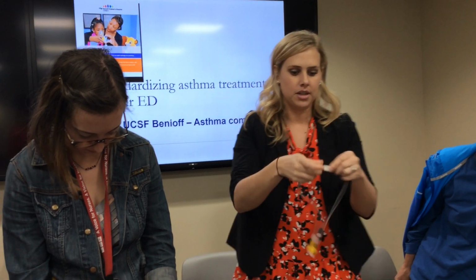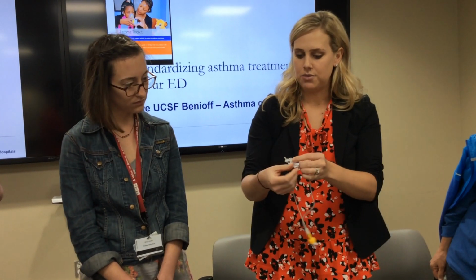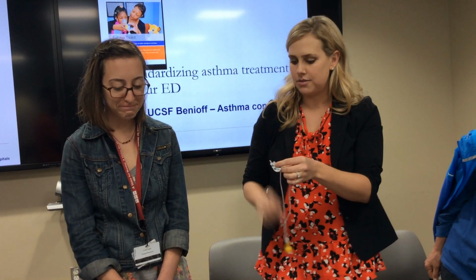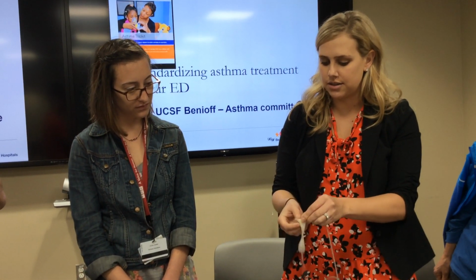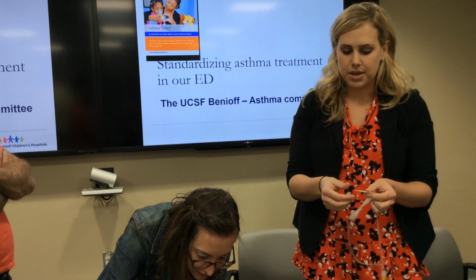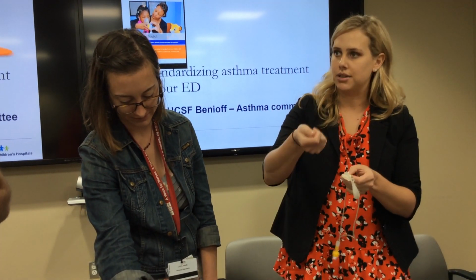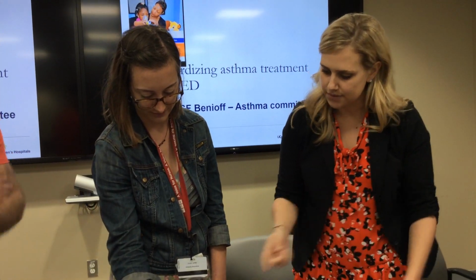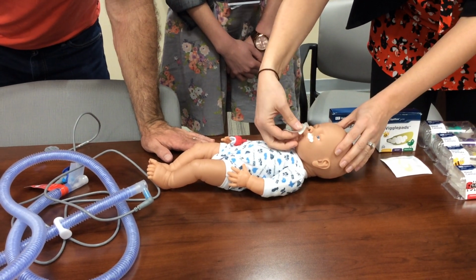As you come down to the nares, or the prongs here, they are actually independent flows, so they do not meet in the middle. If you remove one side or peel it back, the patient is still getting some kind of therapy, but you can do any kind of cleaning or suctioning you need to. What's nice with these cannulas is the little pads on them called wiggle pads. They take the place of dots or tape. It's a hydrocolloid material with a little Velcro on it. You can peel it back, do any cleaning or suctioning you need to, and then quickly and easily replace it.